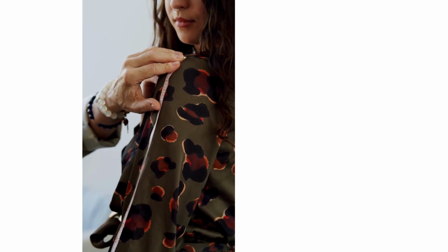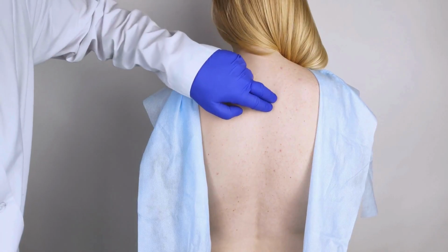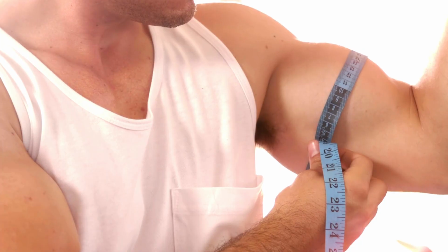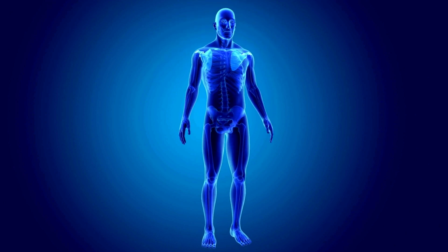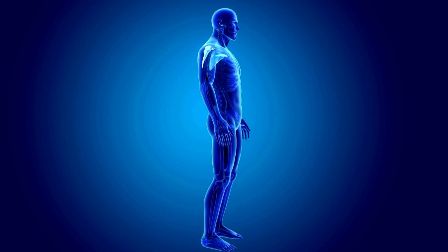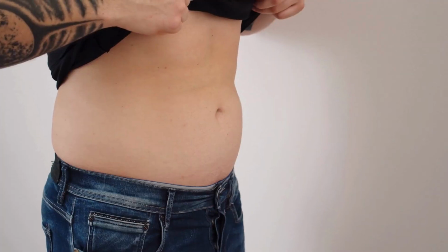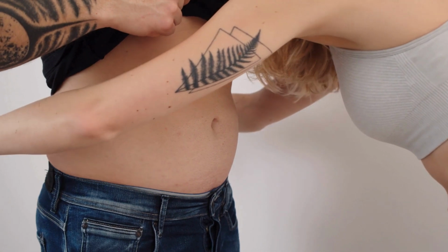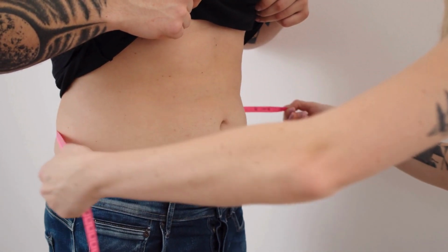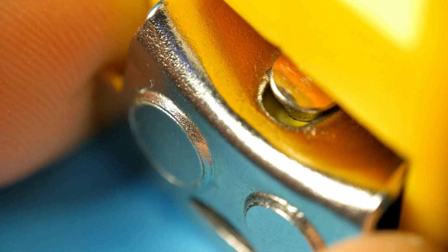It is commonly used to measure body segment lengths for detecting asymmetries, monitoring growth or muscle development, and identifying potential biomechanical issues that could affect posture or movement. The tape's flexibility allows it to contour to the body smoothly, while still maintaining precision. That's why, for this assessment, we don't use hard or rigid measuring tapes.